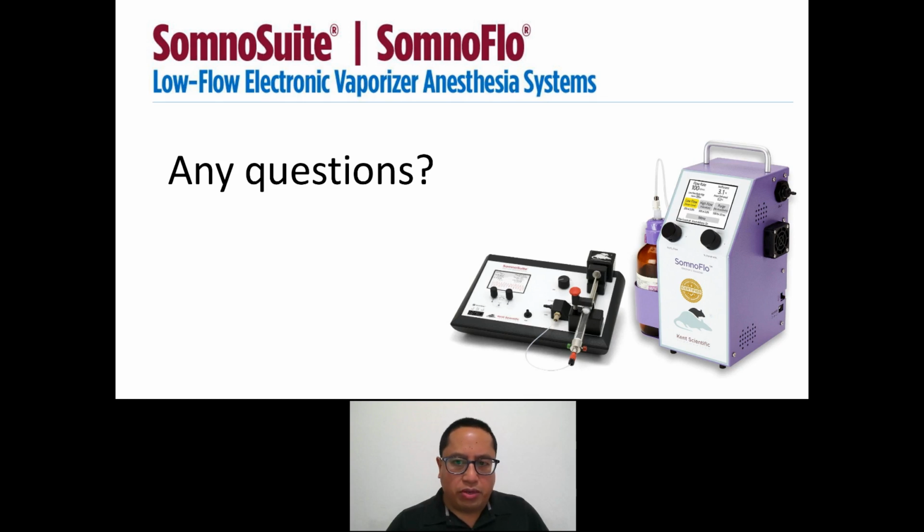I believe this might be a question pertaining to your compressed air or gas that is being used as your carrier for the isoflurane. If so, the only thing that I can let you know is that basically on your compressed gas tanks, your regulators usually are set to either 50 or 100 PSI. That will be too high to connect to the Somno Flow or the Somno Suite. So you would have to purchase one of our preset pressure reducers to drop that PSI down to 15. That way when it interfaces, both the Somno Suite and Somno Flow can work properly. Anything higher than that will not let it work properly. So hopefully I answered that correctly for you.